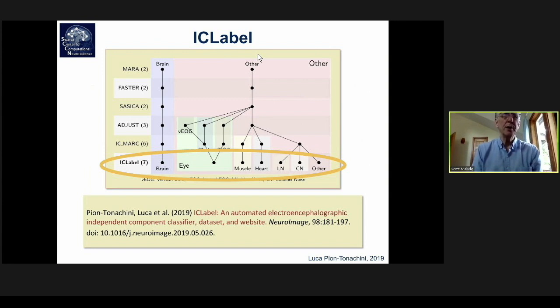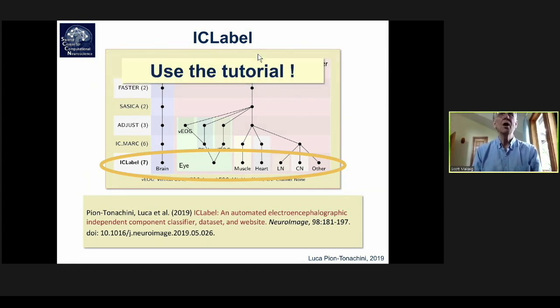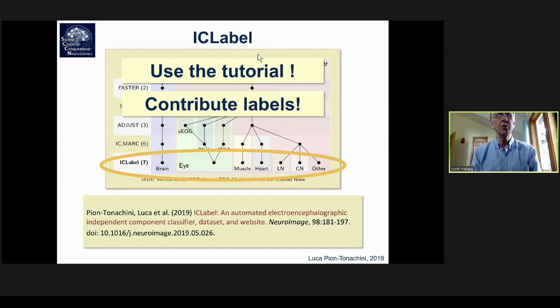So in the labels you're going to contribute, some will be of components that have been rated by experts, and that's basically to test you and to give extra information about those components. And then some will be new, that have never been tested before or not by our experts. So there's a sophisticated scheme for choosing which components to give you. And you can contribute labels, and IC label will continue to get better for you and for everyone.